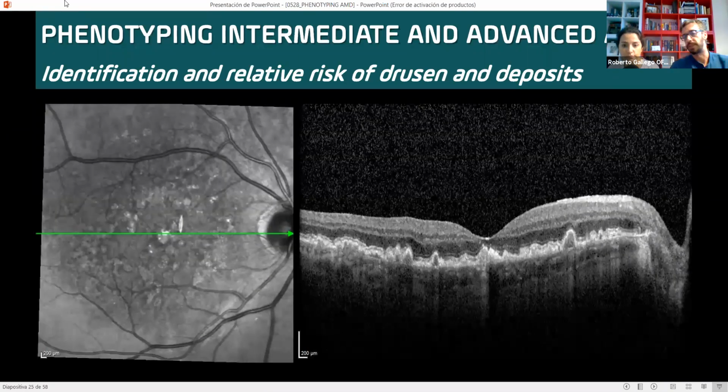So for example, in such a case, I can see similar patterns to what you have just described. Do you agree? Yeah, so there are different drusen that have this hypertransmission in the choroid. So we have to already suspect areas of atrophy in the RPE, and also these hyperreflective nodules within the drusen. They are also normally hydroxyapatite crystals.